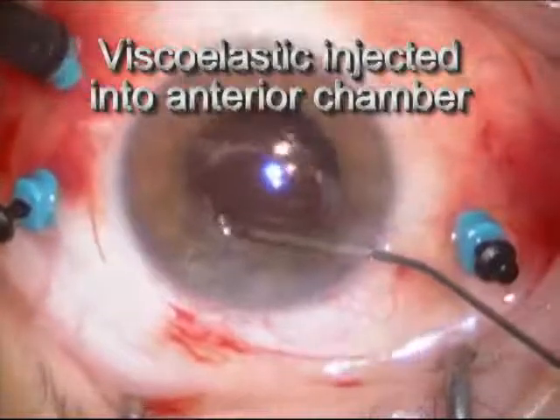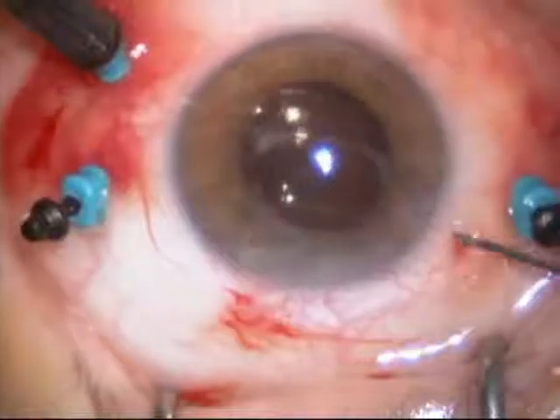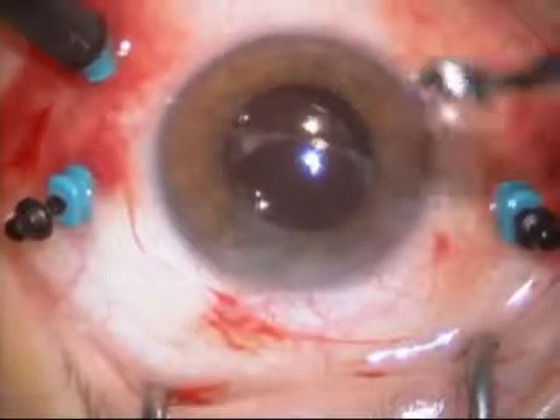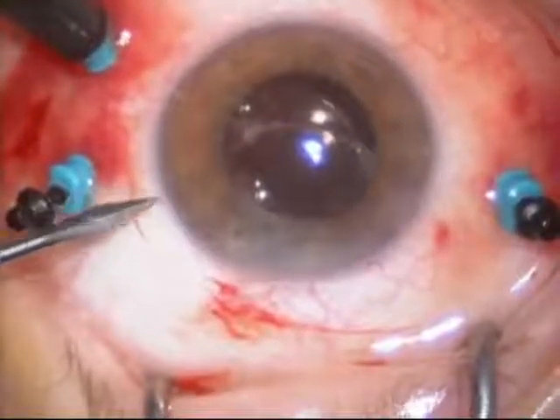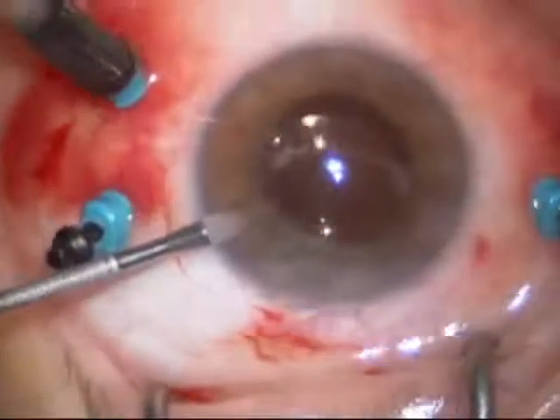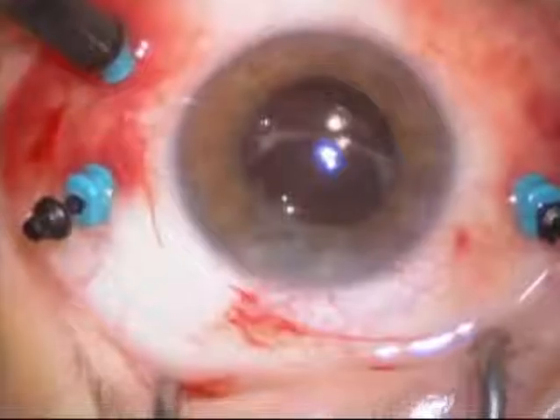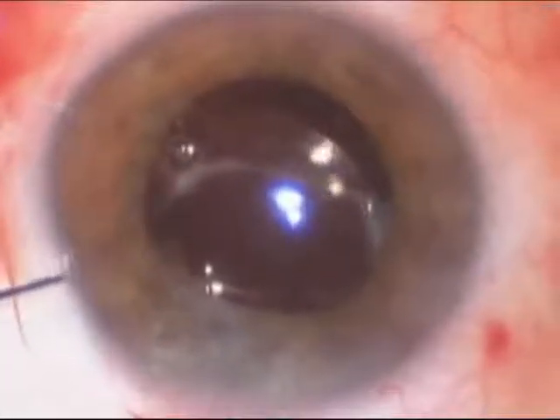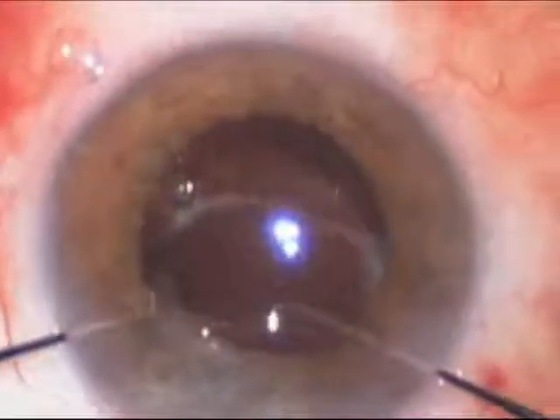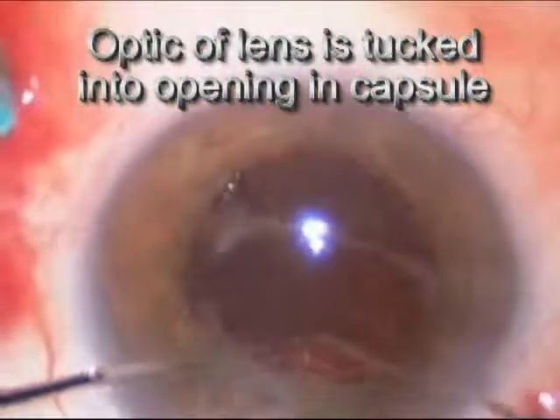Viscoelastic, which is a gel-like substance, is put into the front of the eye. This helps keep the lens in position and also protects the cornea during manipulations performed in the anterior chamber, which is the front of the eye. Now that the lens has been mobilized, it's free to move about in the eye and the capsule has been opened slightly. A second incision is made, and two instruments are needed to put the lens into the capsule opening. What I do here is position the edges of the optic of the lens — which is the round part — behind the capsule.